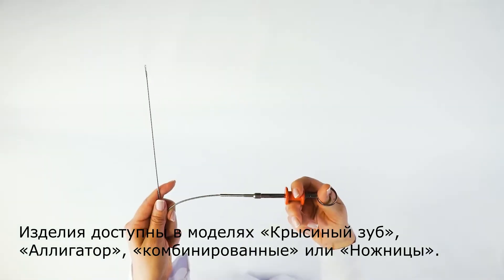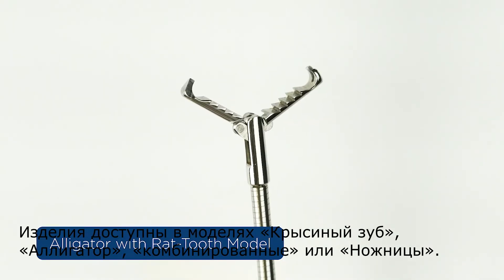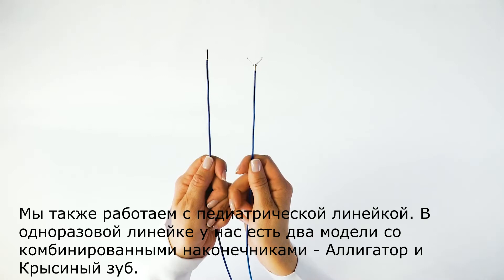They are available in the models: rat tooth, alligator, mixed, or scissors. We also work with the pediatric line.